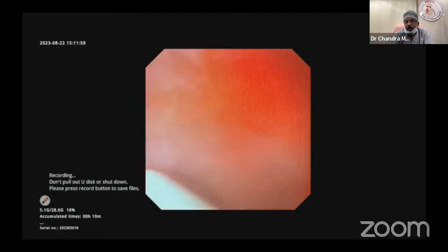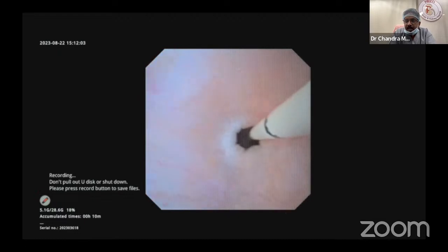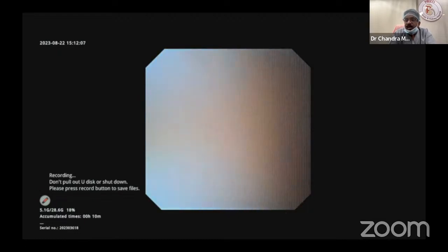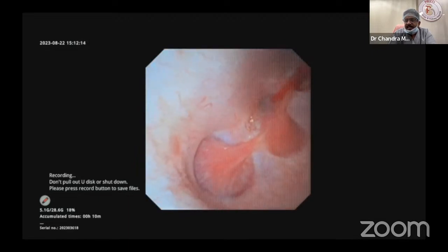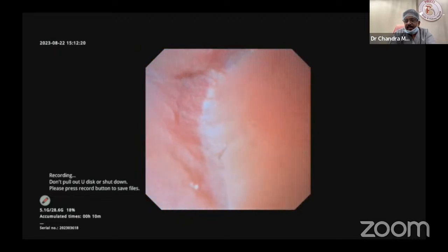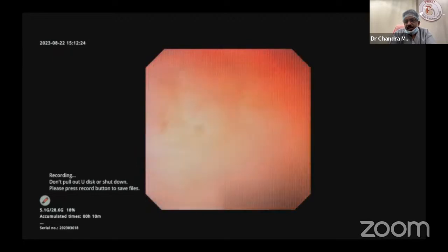Now you see here, I am going into the pelvis, I am going into the ureter, I am going into the mid-ureter. The 13.5 French has gone up to the mid-ureter. What does it mean? No stones distally. Very happy. Now I am going into the middle calyx nicely. Now I am going into the extreme middle calyx nicely. Now I will go into the upper calyx also, coming back a little bit to the upper calyx. Now I am going into the inferior calyx, which is present anteriorly. See, look up.